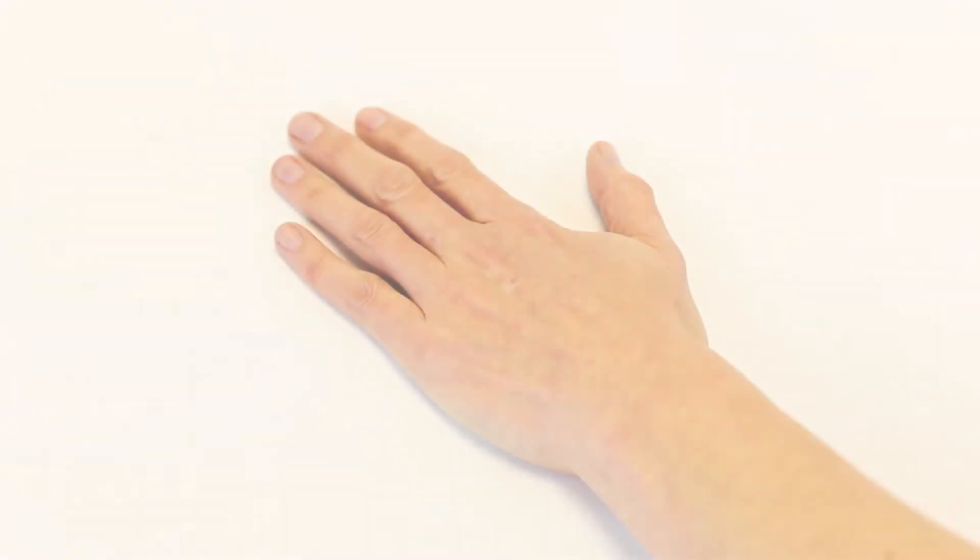To determine which size Sabo stretch you need, just one measurement is required. Ideally, you should place your fingers flat on a table in front of you. If your fingers curl, you can still take the measurement.